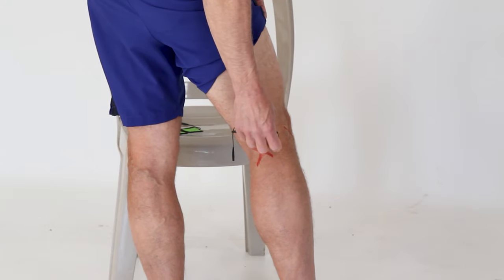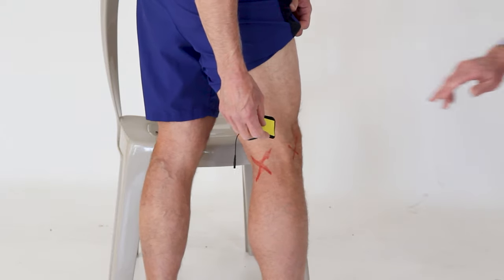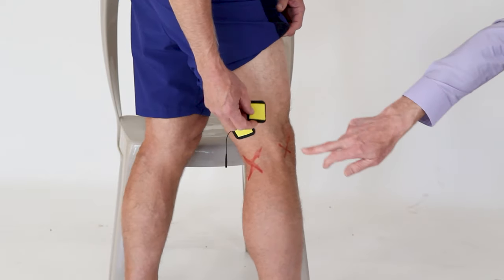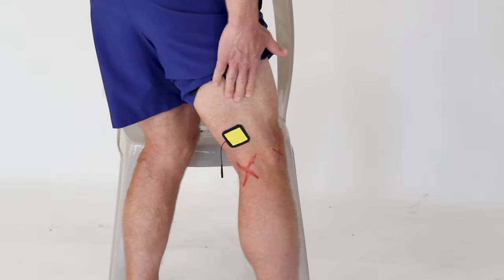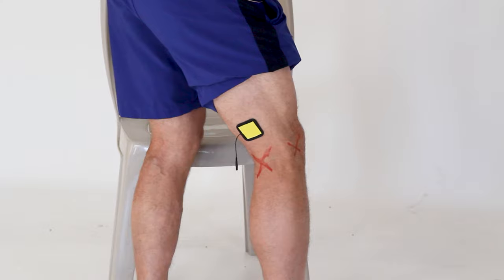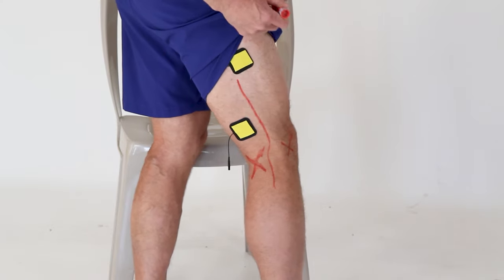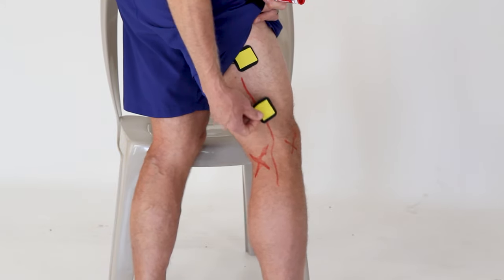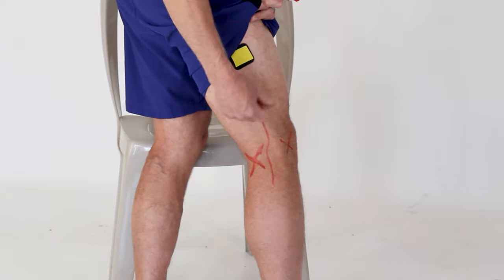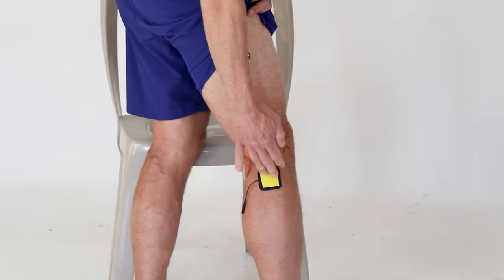So the last thing you can do, if you just have two, let's say the pain's coming from your back. You might want to go along the trail of the nerve. So if you got pain running down here, we'll put one there, and we'll put one here. Now, I would never put it this far apart. I mean, you could try it, but I have a feeling that might be too far apart.